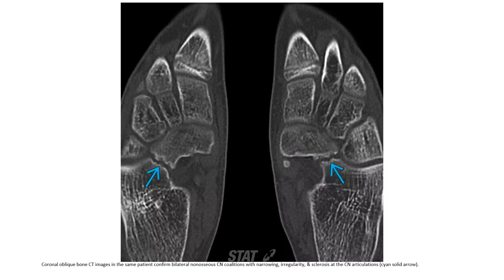Bone CT imaging in the same patient confirmed bilateral non-osseous CN coalition, with narrowing, irregularity, and sclerosis at the CN articulation.